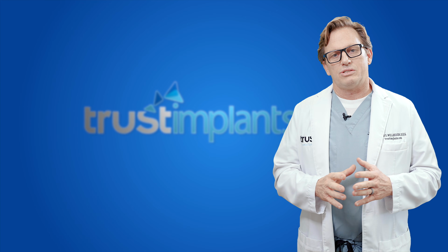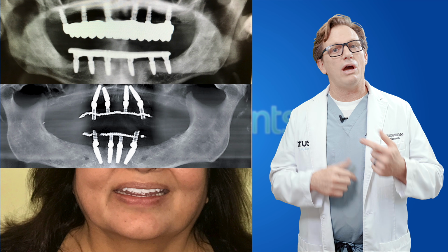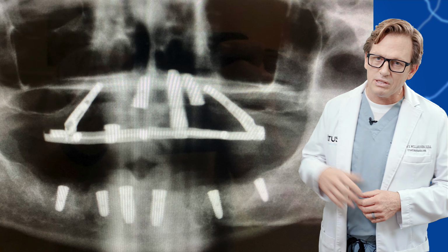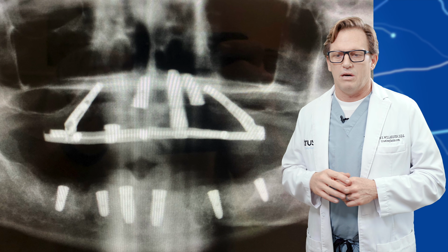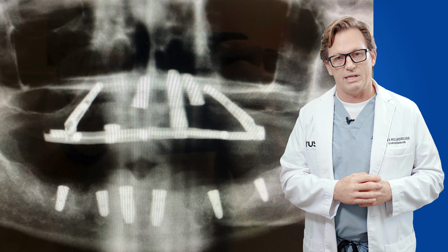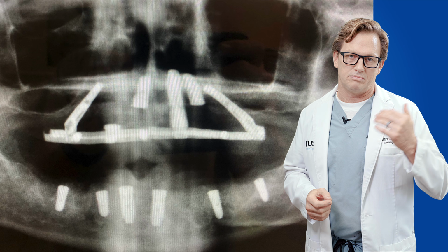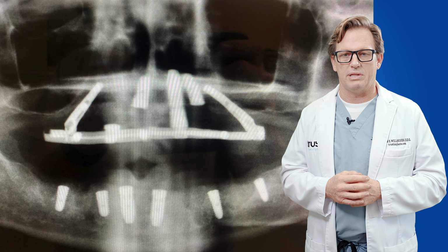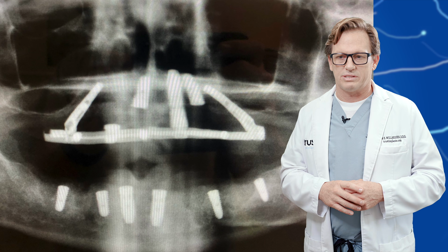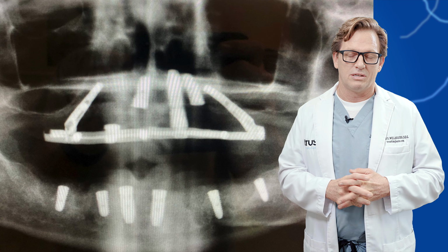So these are patients who have been through the process and now have to go through it again. Let's take a look at this x-ray here. This is a case where the patient went through the process. We had to remove all of these implants because there was peri-implantitis, there was bone loss around each of the implants. So we had to take the implants out, put in all new implants, and make her a new prosthesis.